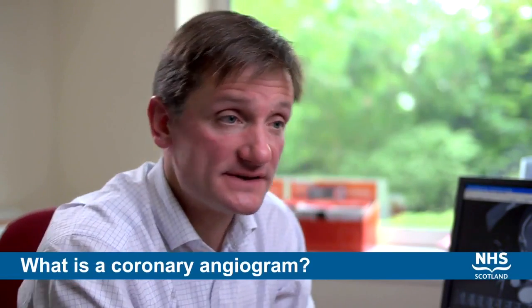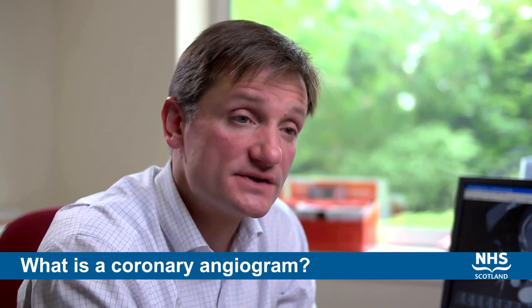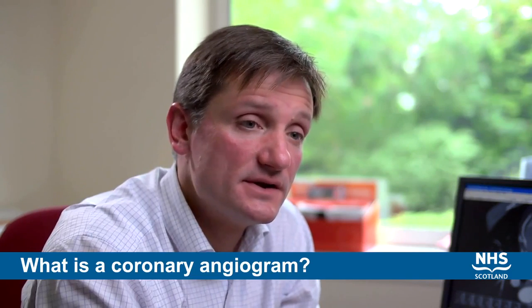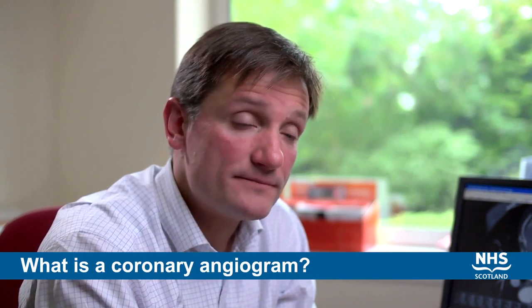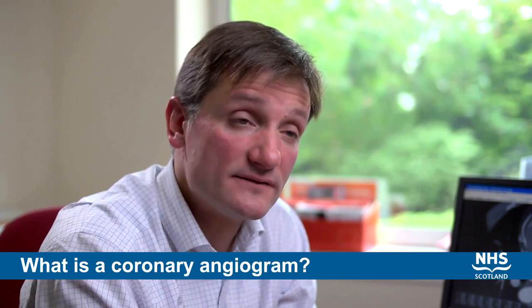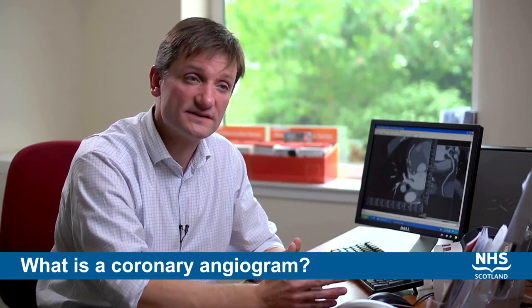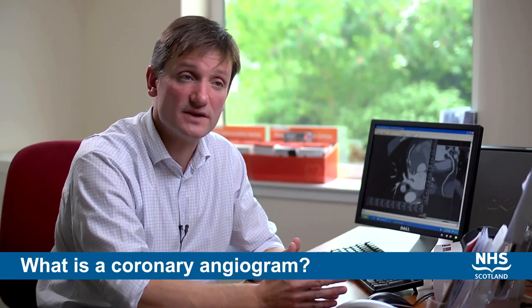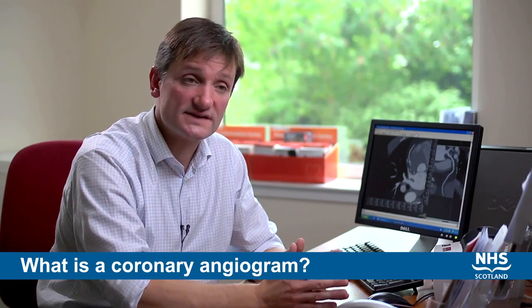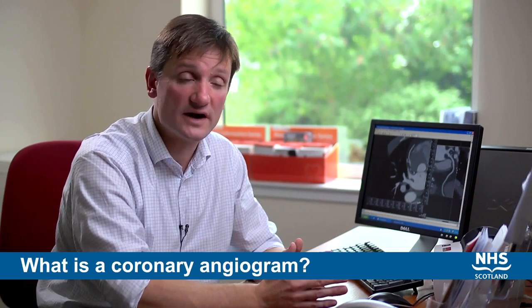You've been invited to attend for a coronary angiogram by your cardiologist who wants more detailed information about your heart in order to plan treatment. A coronary angiogram allows us to look in great detail at the coronary arteries supplying the heart muscle. In patients with angina, it allows us to identify coronary artery narrowings that may be responsible for this symptom. It's also a test that is required in patients who are being assessed for treatment for heart valve disease.